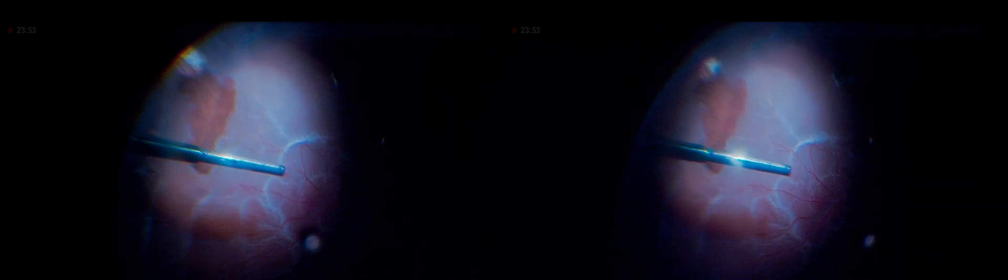By continuing with the retinotomy, you have to go superior and inferior very carefully, taking a very good look at the periphery and avoiding those peripheral retinal vessels so as not to cause any bleeding. You see that as you perform the retinotomy, it shortens.